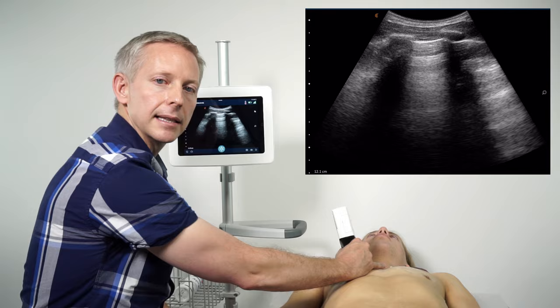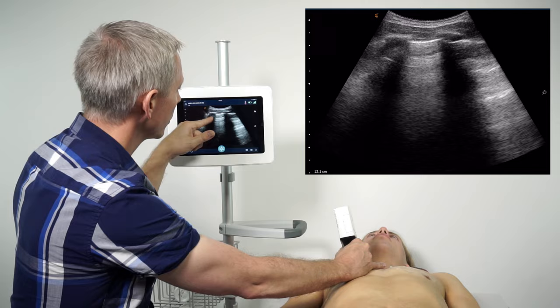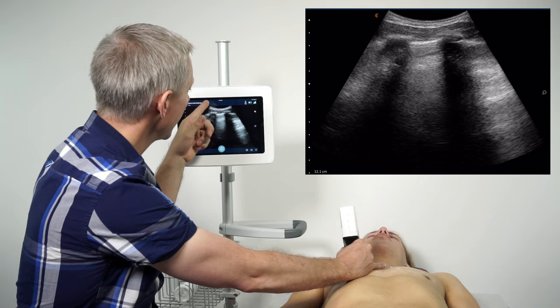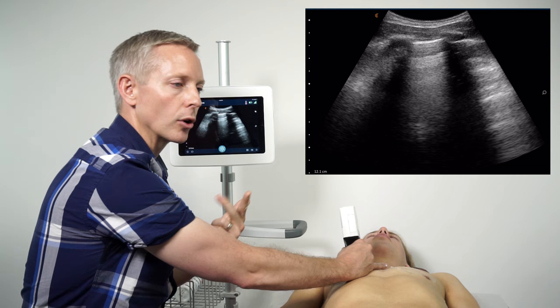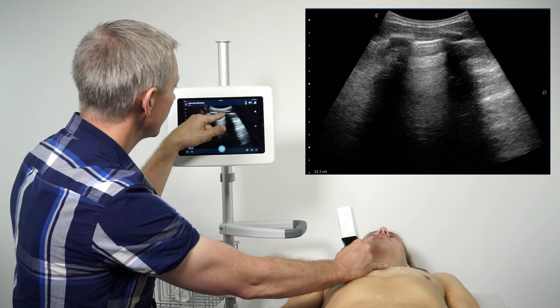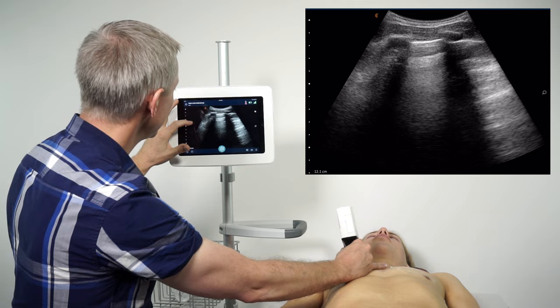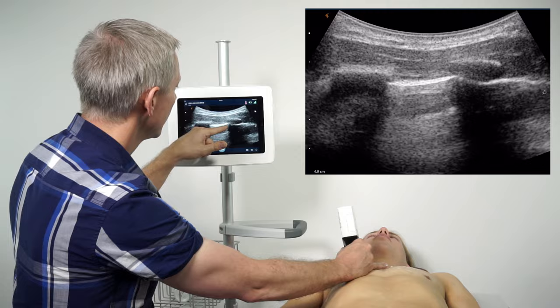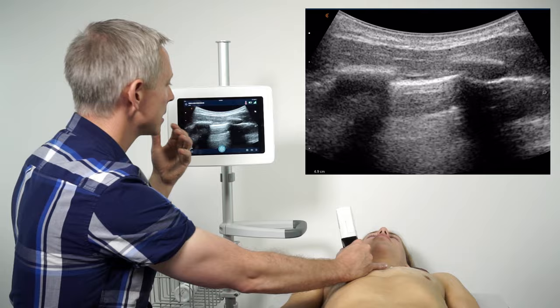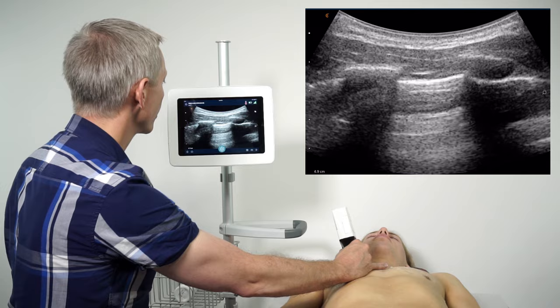I can't say for certain with A-lines alone that this is a normal lung, as we can see A-lines in anything with a soft tissue-air interface, including a pneumothorax, COPD, or a large pulmonary bleb. I can differentiate a normal lung from a pneumothorax, however, given the presence of pleural sliding across the pleural line. Sometimes it's difficult to see at a depth of 11-12 centimeters, so I can zoom in to accentuate the pleural sliding. Pleural sliding is a very sensitive sign, and its presence here rules out a pneumothorax.